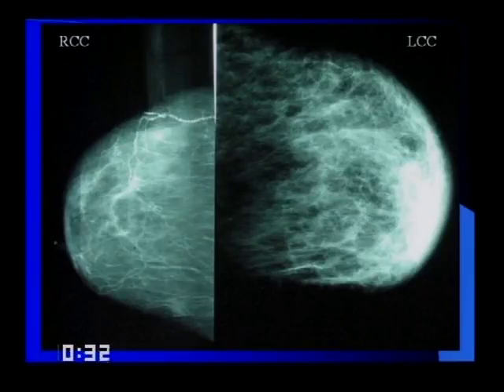So as opposed to the Paget's disease we saw before, this is an inflammatory cancer. The whole breast is big. The whole breast is dense. And the skin is burned out. This is the problem a lot of times with inflammatory cancers. It's hard to position it because it's just full, it's heavy, it's obstructed because of the inflammatory cancer. And how is inflammatory cancer diagnosed?